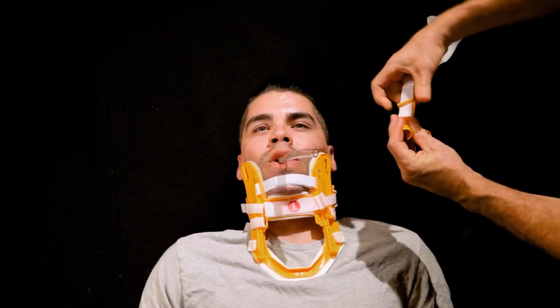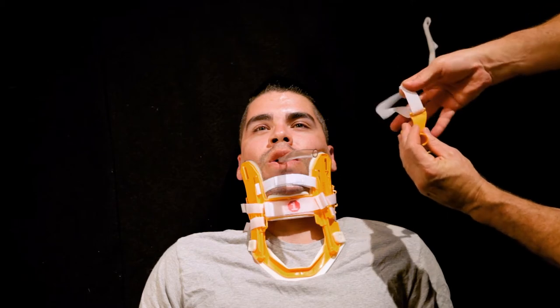Airway Management. For airway management, use the tube holder and one safety strap.